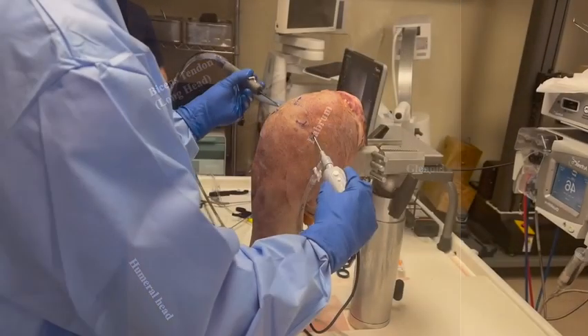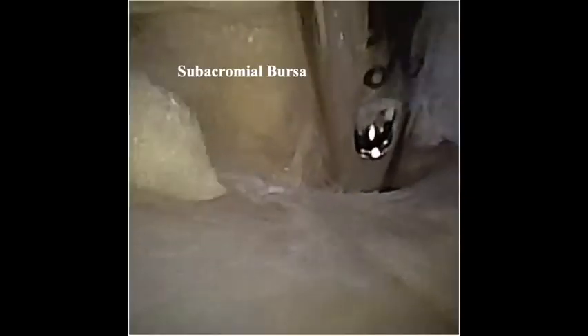Attention is then turned to the subacromial space. A 2mm shaver is inserted into the anterior portal to debride the subacromial bursa and expose the undersurface of the acromion, as well as the anterior and lateral edges. The bursectomy proceeds in an organized fashion, from anterior to posterior and from medial to lateral.